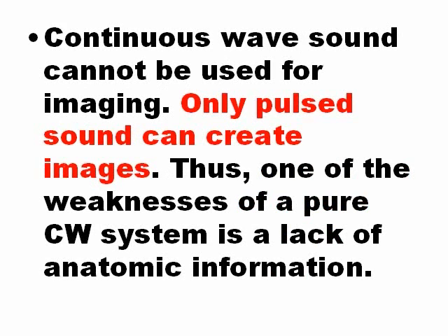Continuous wave cannot produce a picture. That is only for pulsed ultrasound. This is the problem of continuous wave Doppler systems. There is no anatomic information.